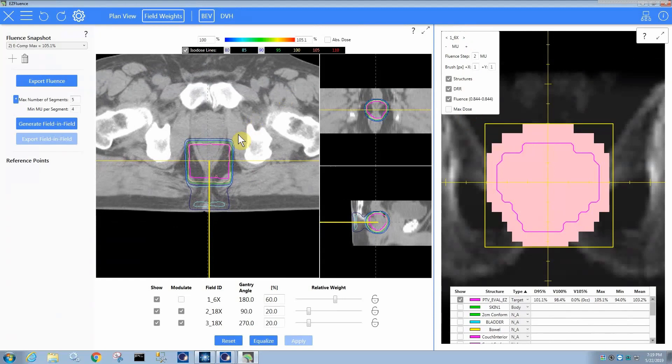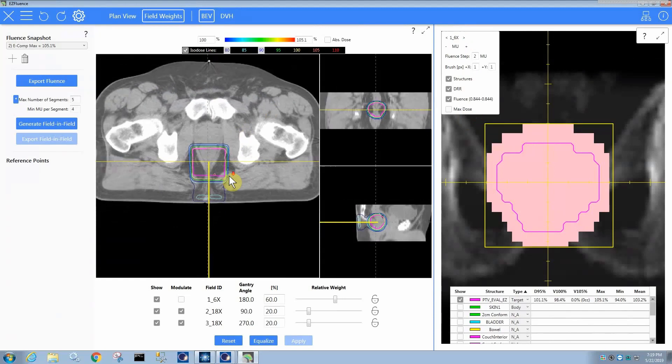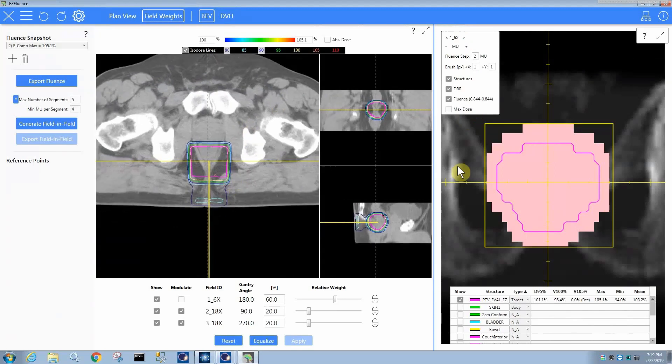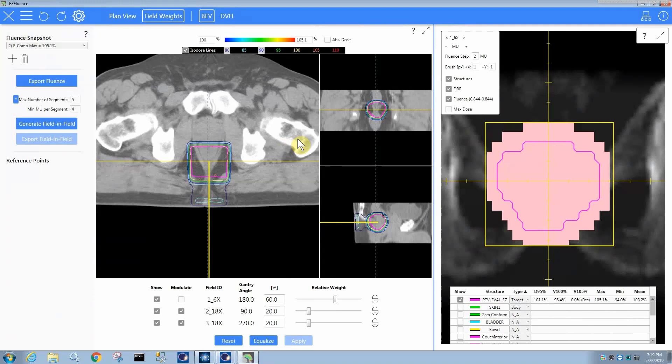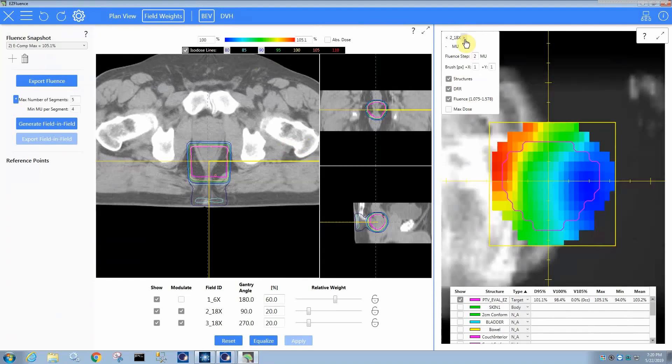Very much like Eclipse, you can hold down control and zoom. And the same with the beam's eye view, you can do the same thing. So it's a nice way to check things from a different area or whatever. And so as this particular field is the PA field. You can see it has a uniform fluence, which is why it looks pink. So it doesn't have any type of modulation.